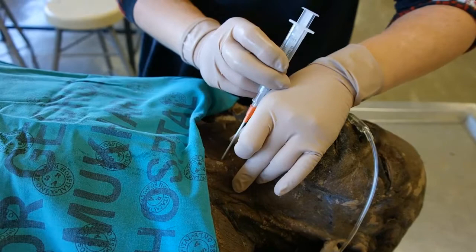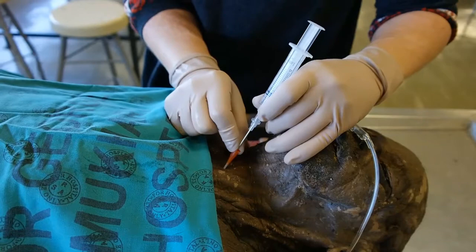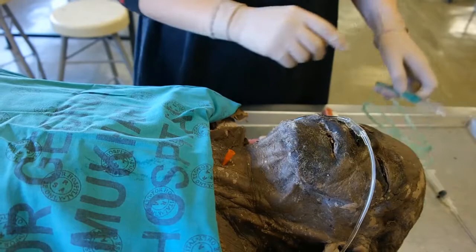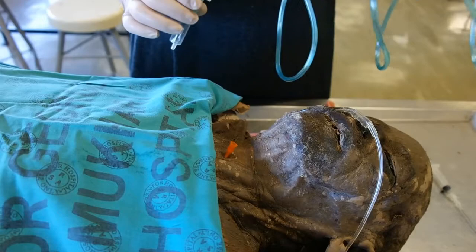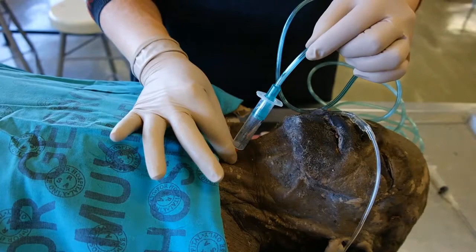Taking the over-the-needle cannula attached to a small 5 ml syringe, puncture the skin over the membrane. Aspirate to ensure that you are in the trachea and gently advance the cannula over the needle as far as it will go. Remove the needle. Now attach your 5 ml syringe attached to oxygen tubing, which is attached to an oxygen source. Attach it to your IV cannula and secure the IV cannula with your fingers.